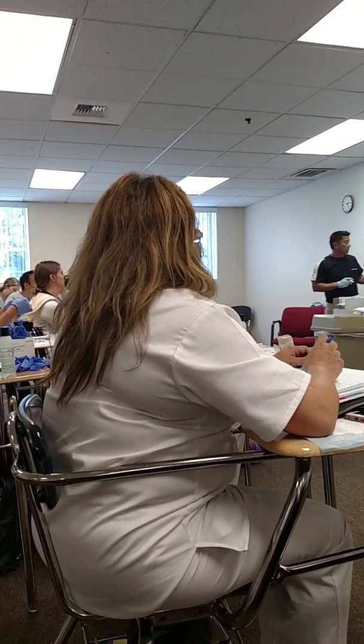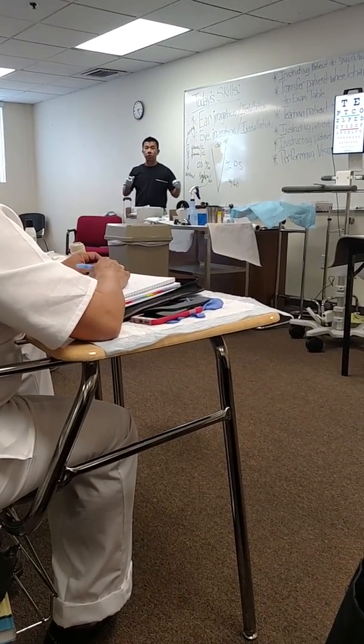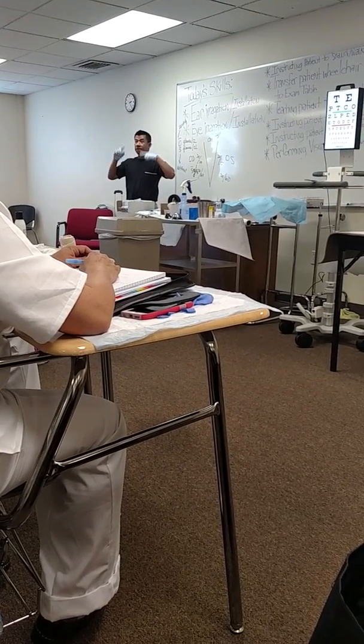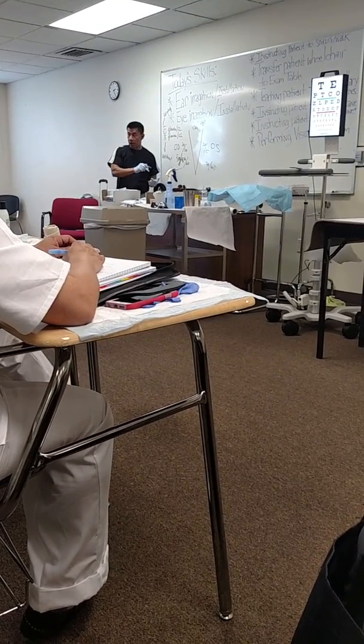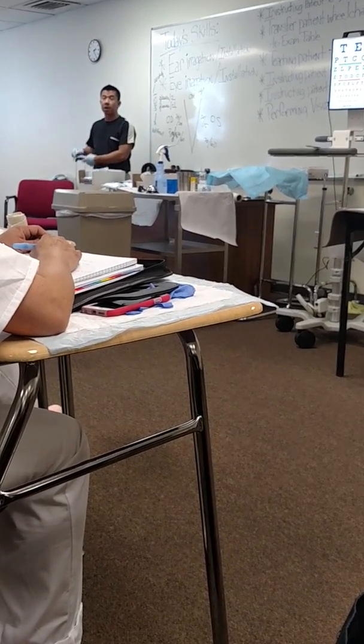Is there a special way to designate with and without the pinhole? Yes, in terms of documentation? Yeah. In your documentation, you cannot document everything you did, so just keep in mind that the final reading will be with or without the pinhole. When you use the pinhole, you can always put it on the side or in your cheat note. As a medical assistant, you will do that. What the doctor would like to see is your final reading.